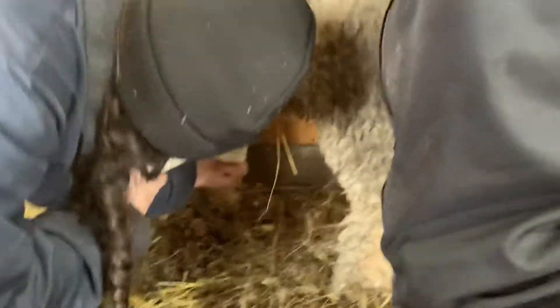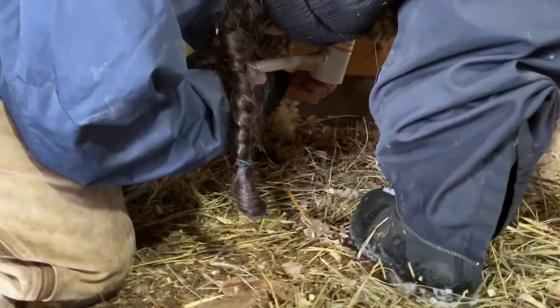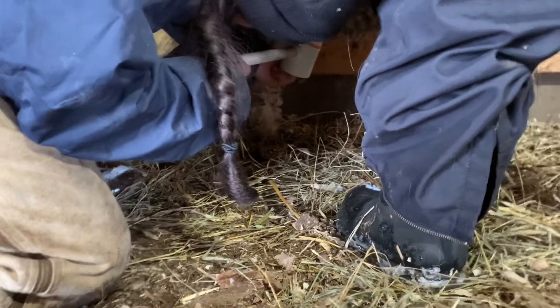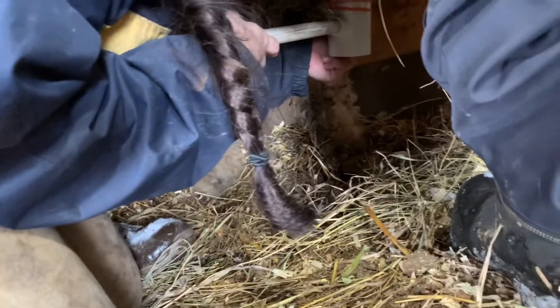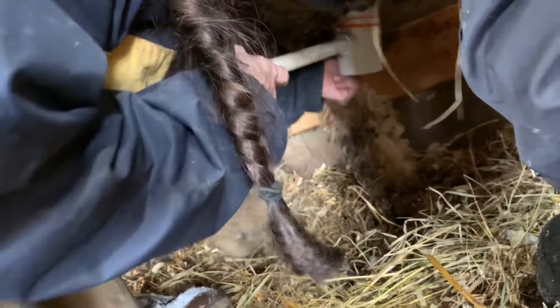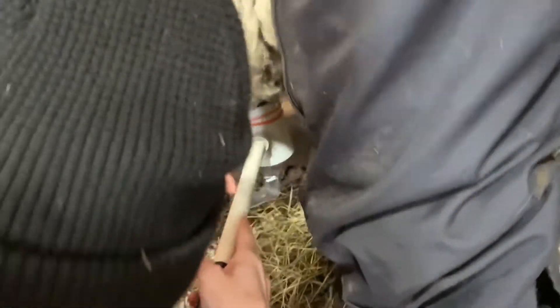What we're doing is collecting semen from these rams. Semen contains all the cells that swim up into the ewe's body to reach the eggs, which makes the lambs. We're checking the motility — how well his cells swim up into the body. Right now we're trying to get the semen out of him so we can check it on a device that measures his motility, to see if he can breed well and have good lambs.